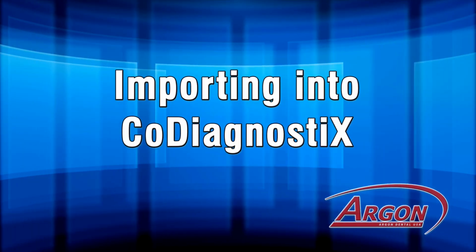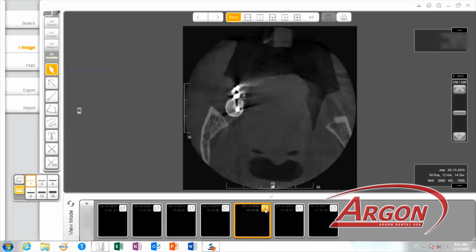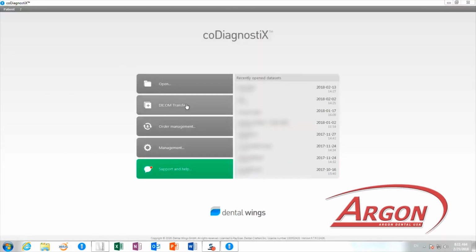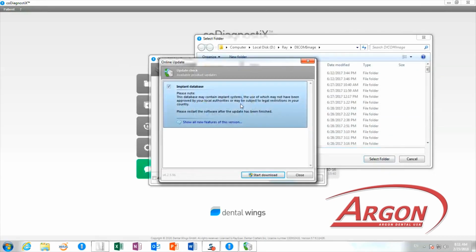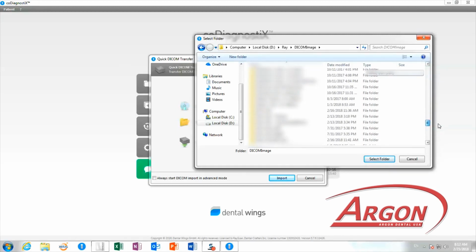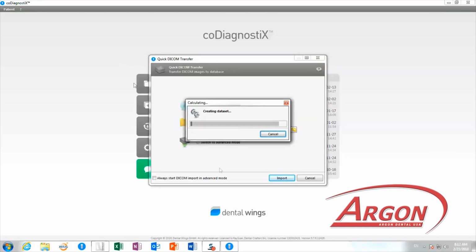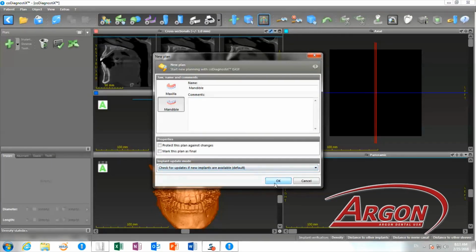Another way of exporting your file is to directly export them into CoDiagnostic software, if you have the software in your computer. You can select the 3D viewer as your exporting method that will launch the CoDiagnostics software. And using the DICOM transfer tab, you will again locate your file and import it into your software.